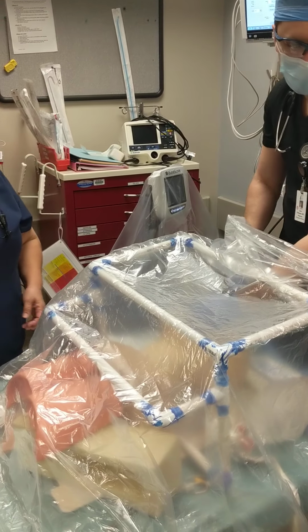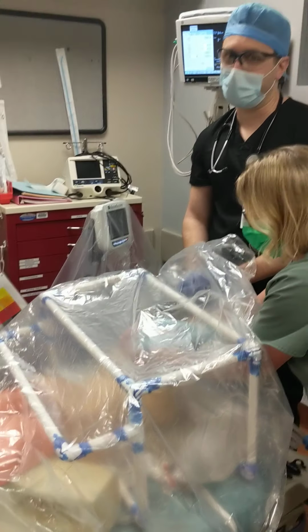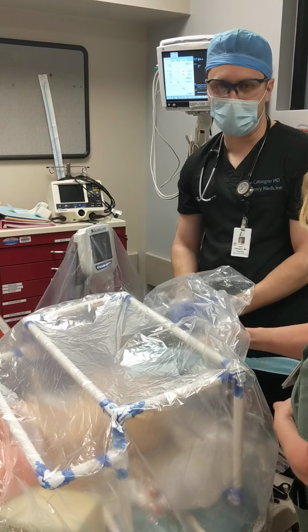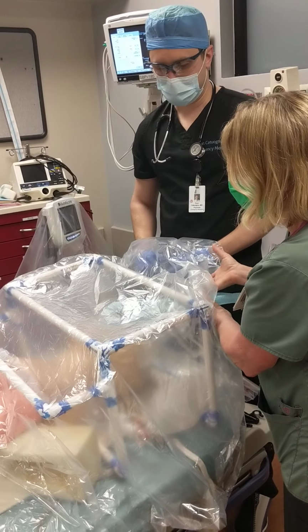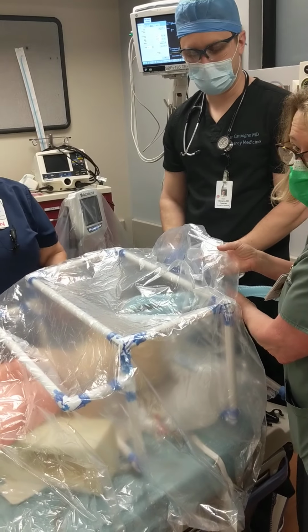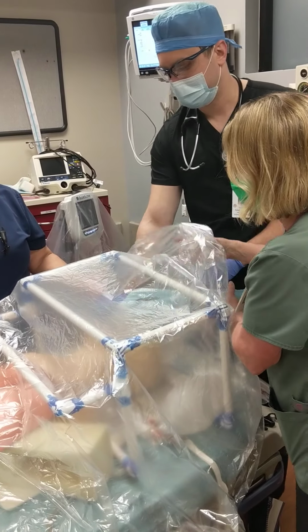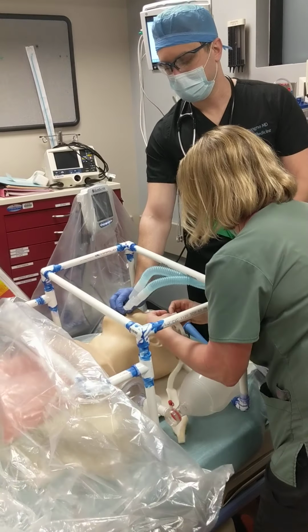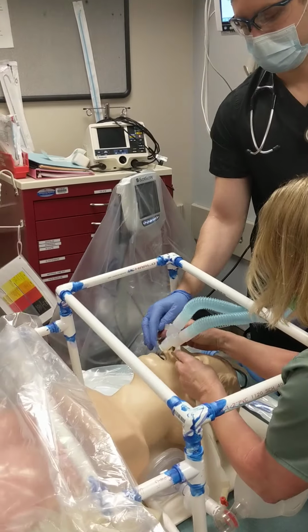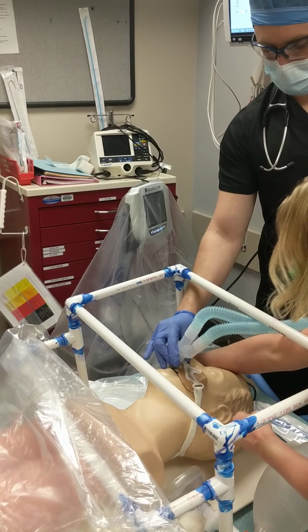Okay, so we've intubated. We've got them on the ventilator. We connect directly to the ventilator without doing any bagging if possible. And then we're going to need help securing the tube. At this point, we're in a closed system. The doctor is going to help us hold the tube while I tape the tube with my system here. The doctor is going to help us as a second set of hands on this.